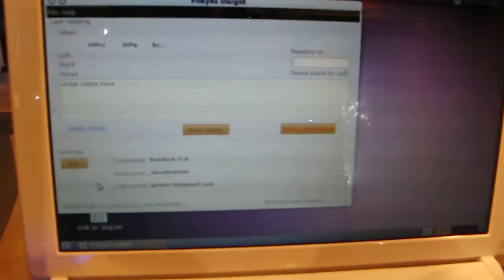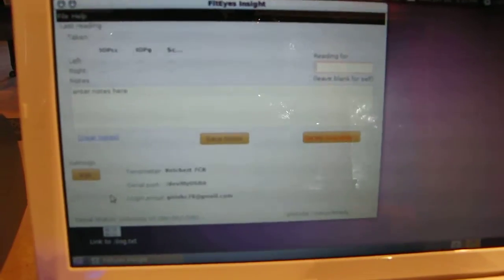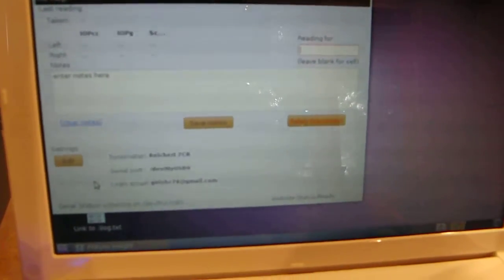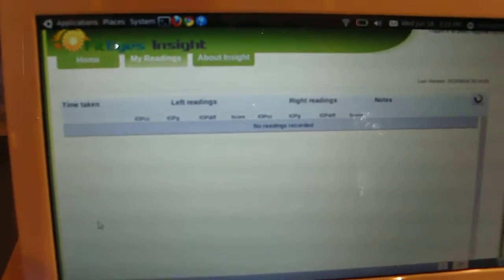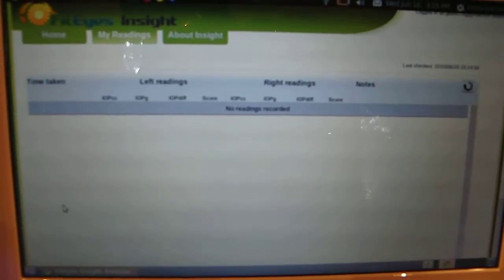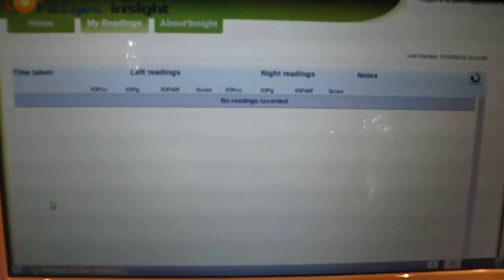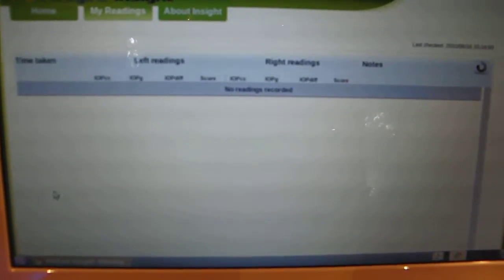Now in addition to the FitEyes Insight application, we have a web page, FitEyes Insight web page. This is your private password-protected web page that organizes historical records of your IOP data. There's no data in this demonstration web page at the moment.